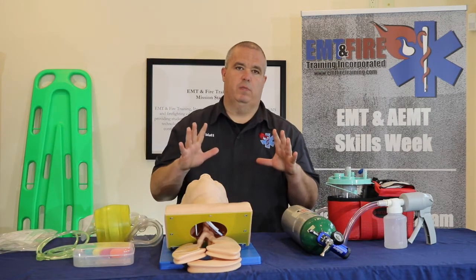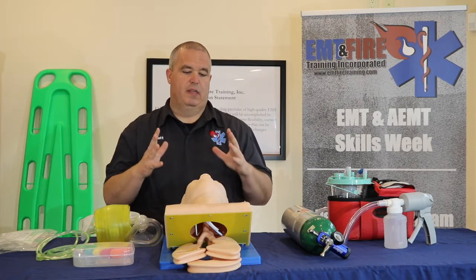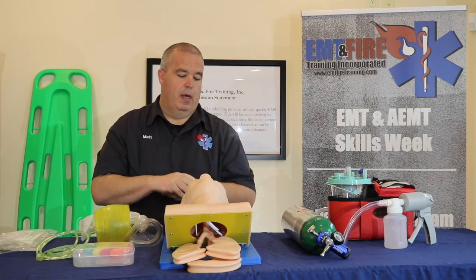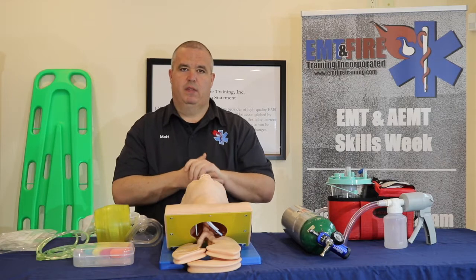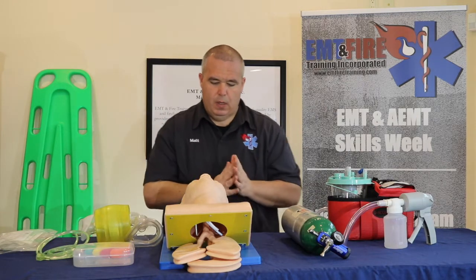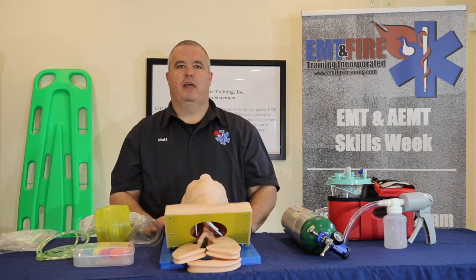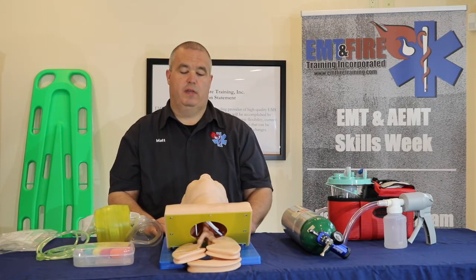The first thing we always want to do is make sure we're in proper PPE — gloves, eye protection, and even a mask if available, since we are going to be working with this patient's airway. First thing we want to do is check responsiveness. We want to make sure this patient isn't just sleeping — that he is truly unconscious and unresponsive.